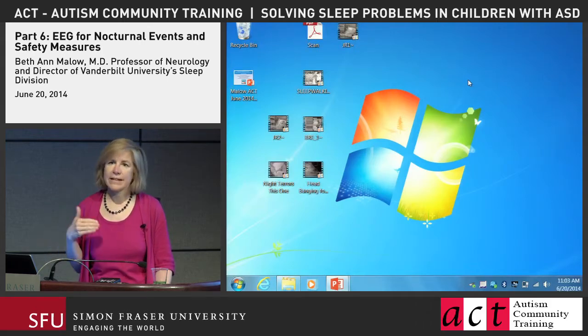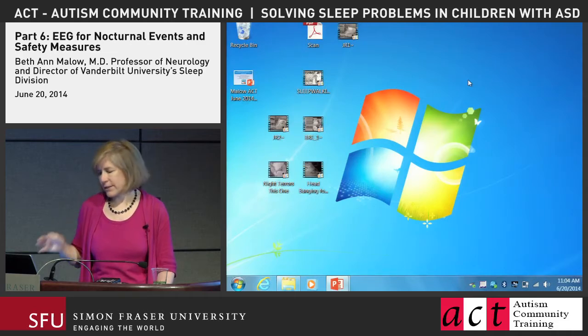I would put on a full head EEG if I was concerned, so I could look at the EEG as well. I would also see if the parent could capture some videos that I can look at. The child coming and waking up the parent at 3 a.m., being fully awake, being coherent, is not as concerning. There still could have been something that woke up the child, like sleep apnea or whatnot, but it's very different, a different set of considerations that I would have for wanting to investigate.